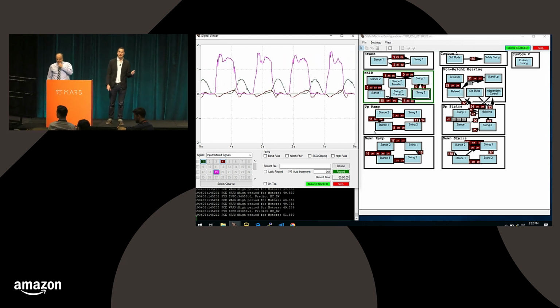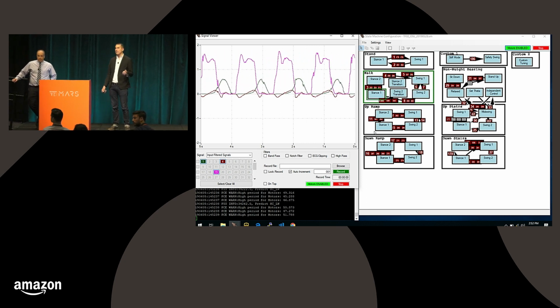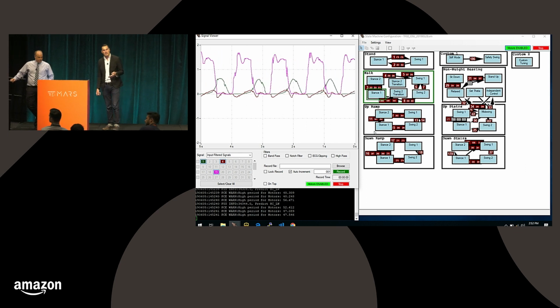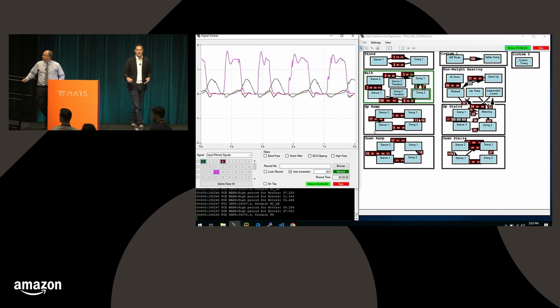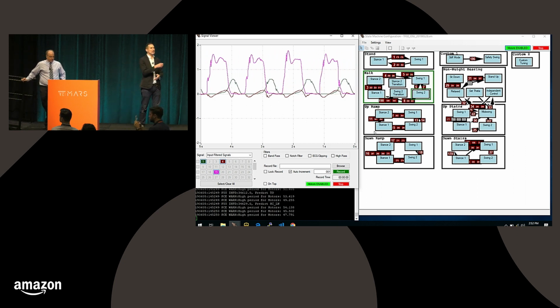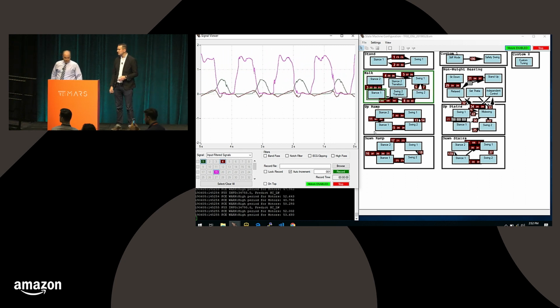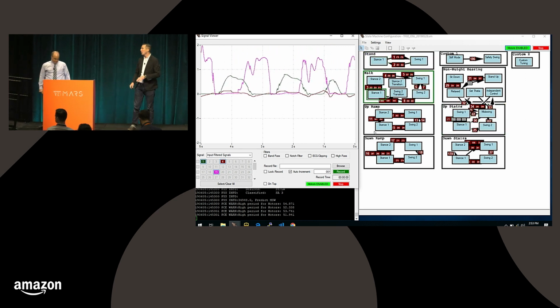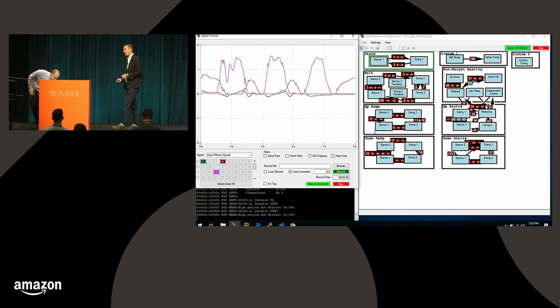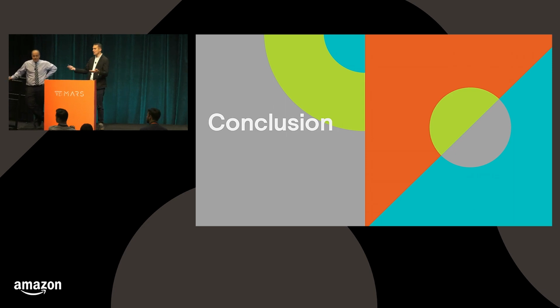The pink signal is the vertical ground reaction force, or the amount of weight that he's bearing on the leg. The green signal is the angle of the knee joint. And the red signal shows the angle of the ankle joint. So the classifier is continually looking at these signals, breaking them into features, and then detecting activity mode. So Terry's going to come up on stage. We're going to pause here. We're going to transition back to the presentation. We'll have a brief conclusion, and then we'll answer questions. And you're welcome to ask Terry any questions that you might have about the bionic leg.